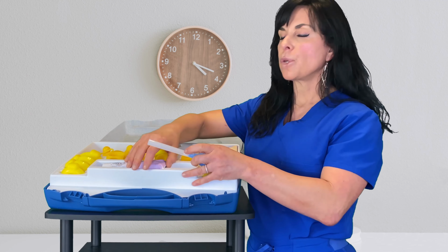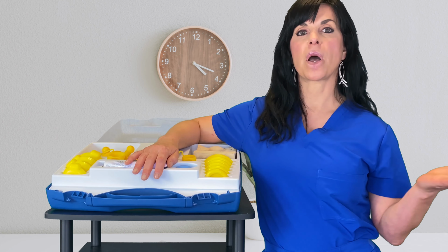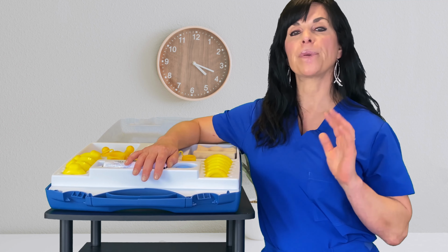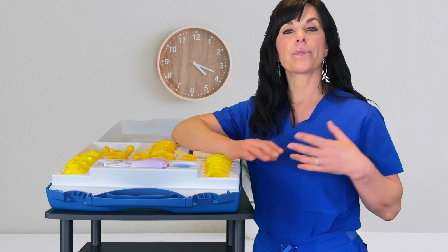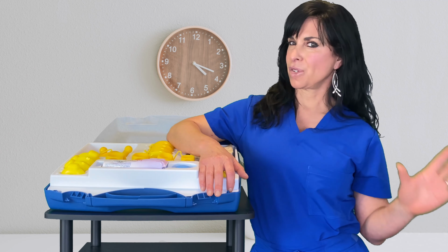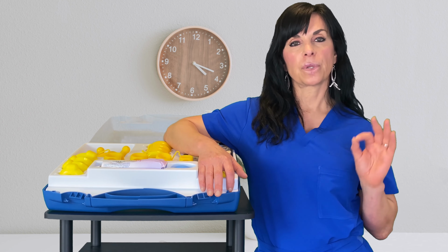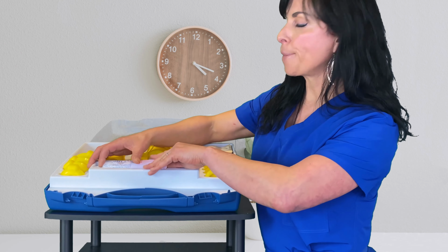So the reasons that you would have to call us, notify us, or come into the office or go into the emergency room if we're not in the office is if you have bleeding that is heavier. For example, you might have some spotting upon insertion and removal because of the little bit of tissue trauma, especially with the bigger ones. Or if you have discharge that has a color change such as green or yellow, something that just doesn't look normal or smells bad, as well as a fever. A fever of 100.4 is typically the number that would bring you in. And then lastly, it would be pain.